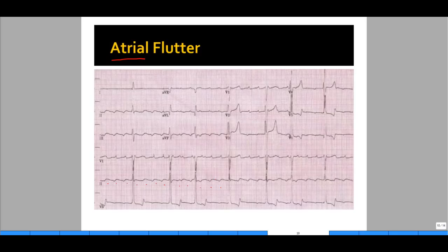Also interesting about this EKG is that you see hyperacute or hyperpeaked T waves, commonly associated with hyperkalemia. Keep that in mind when you see those peaked T waves. What's really important about atrial flutter is: one, the patient can decompensate, or two, can flip into AFib or atrial fibrillation.